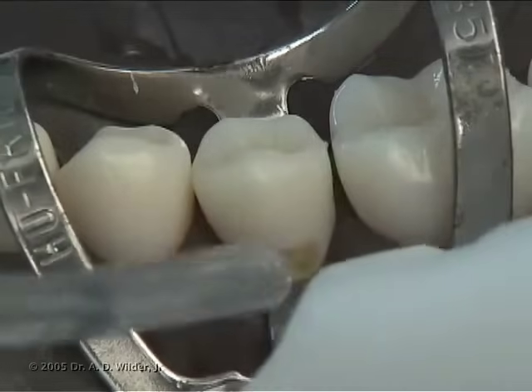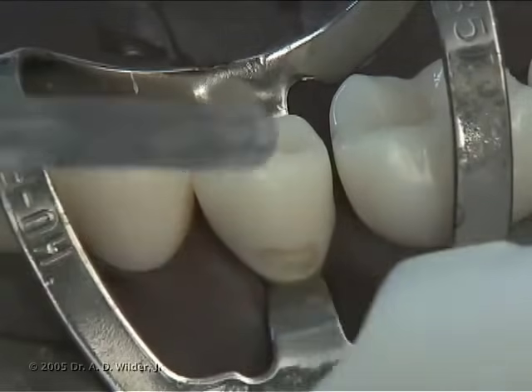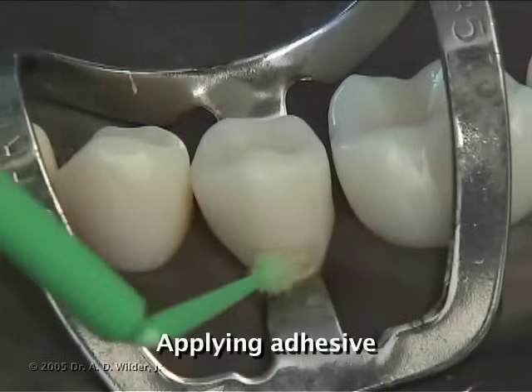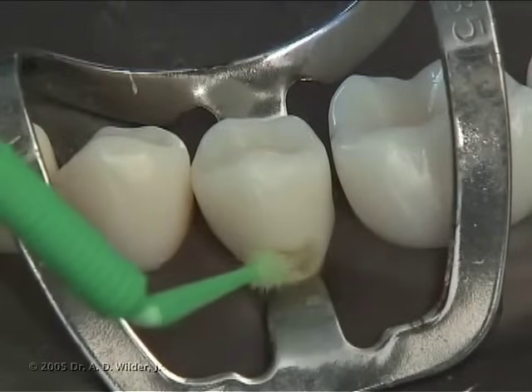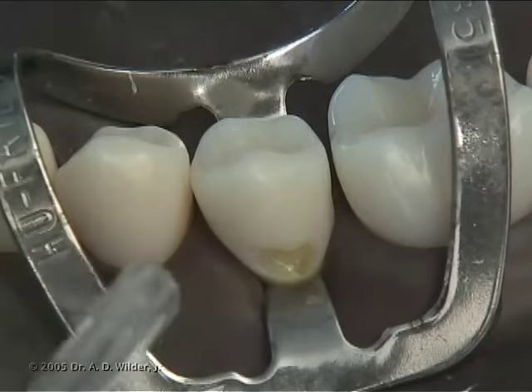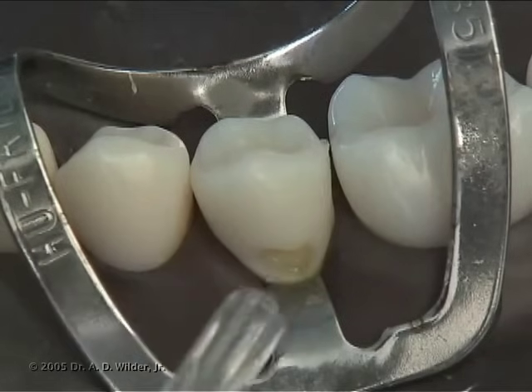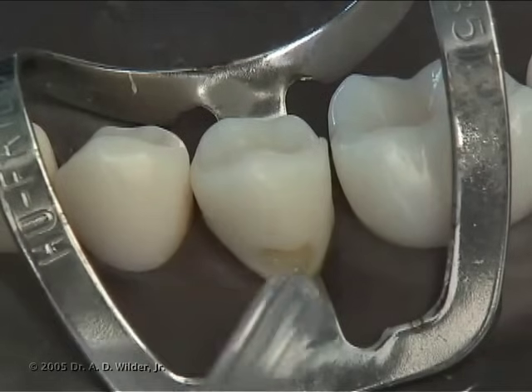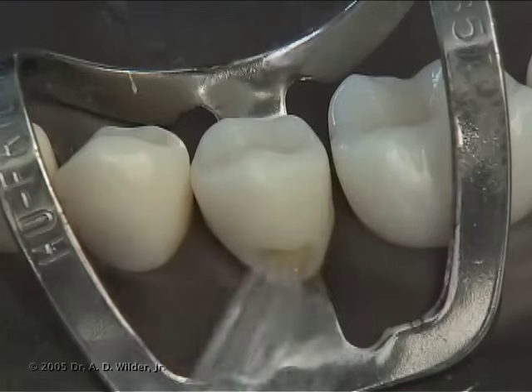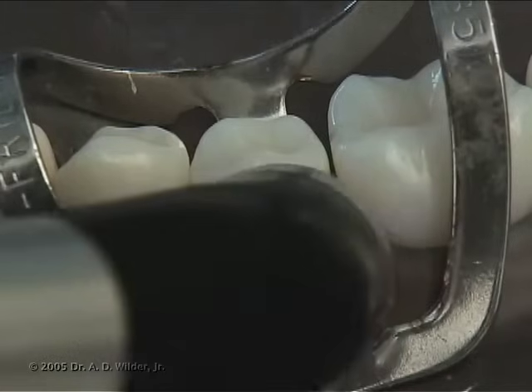Gently dry the tooth, but leave it somewhat moist so you don't collapse the dentin collagen fibrils. Apply and scrub prime and bond adhesive with a micro brush to all walls and floors of your preparation. Gently air thin the bond to evaporate the solvent, and then cure for about 10 seconds.